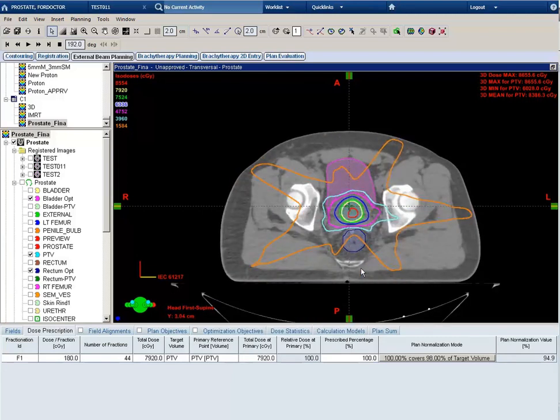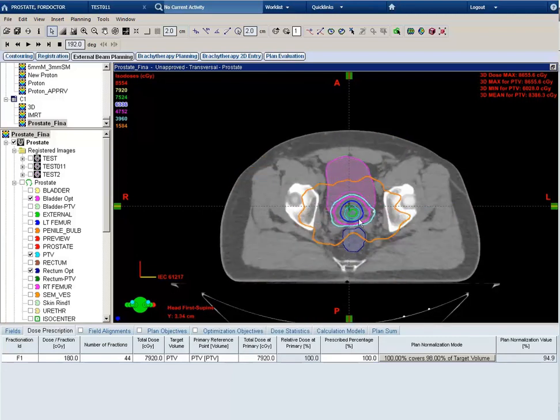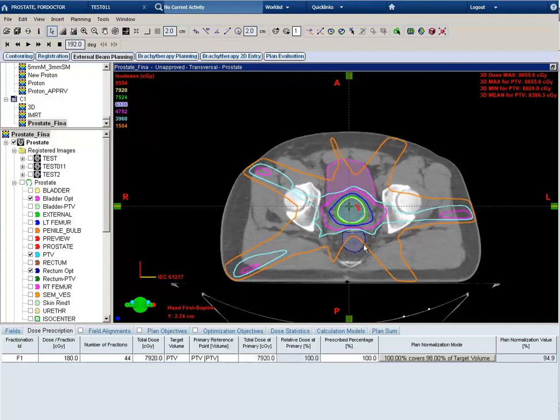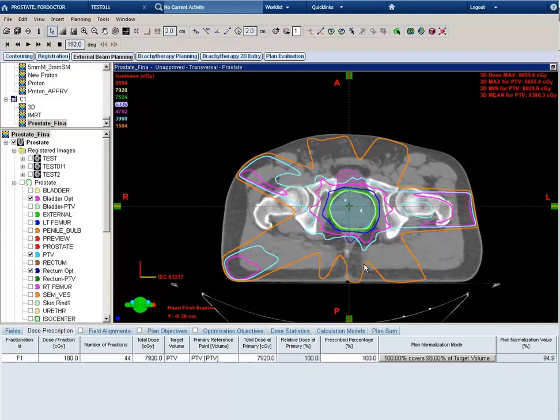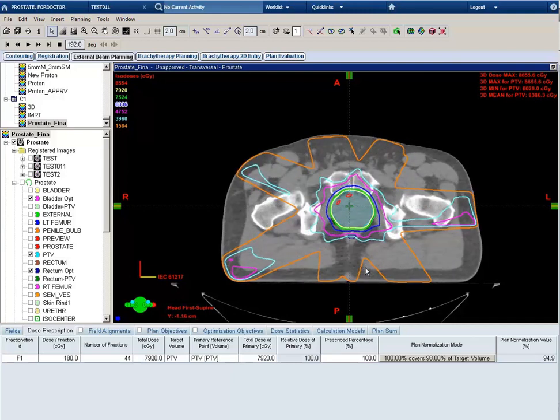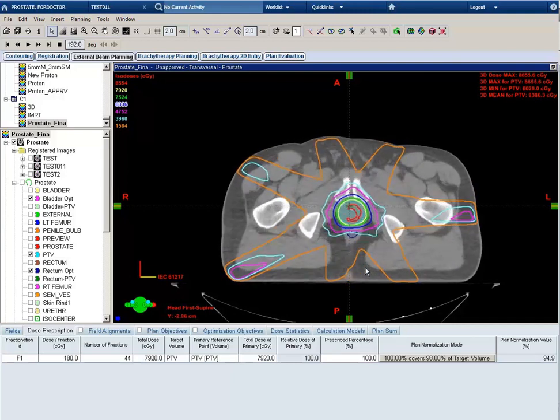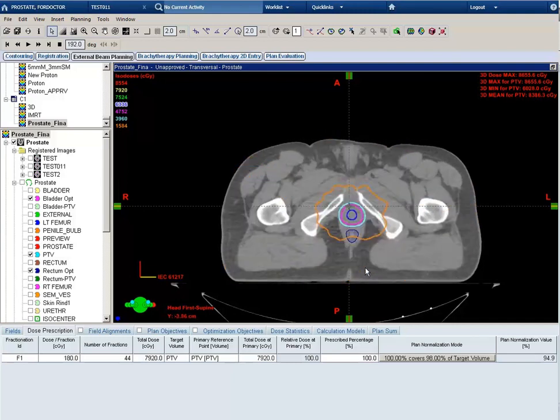Let's look at our isodose distribution. You can see the most superior slice we are underdosing the PTV, but everywhere else looks to be pretty good.